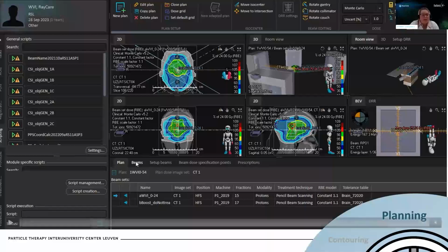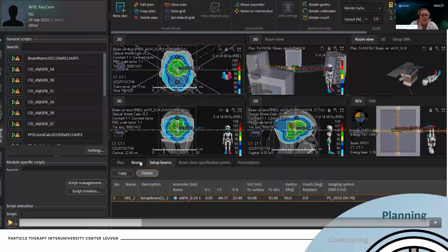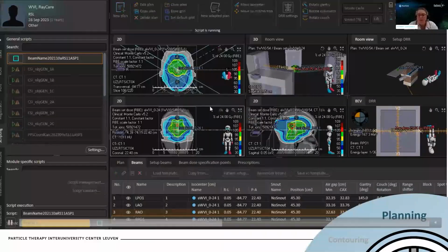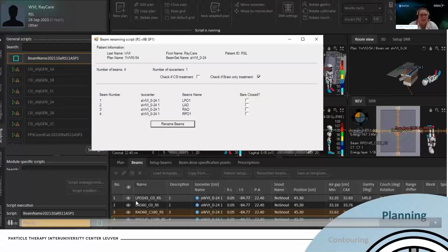First of our tidying up steps, to get the video started, is that you need to make sure to have only one setup beam. So RayStation makes 3 setup beams by default, and the IBA system only accepts a plan with a single setup beam, so we always need to manually delete 2 setup beams. Secondly, we also need to order our beams to the ideal order, so the most efficient order on our machine. And also to make our RTT life on the machine easier, we also rename our beams to a sensible beam name. So my colleague Antoine made a really lovely script, which you see running here, where we can name our beams automatically.